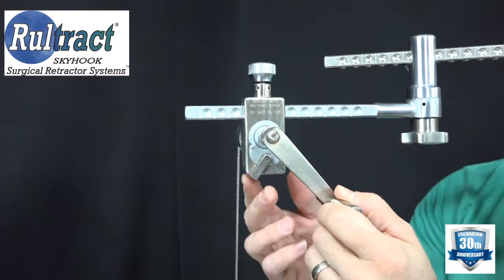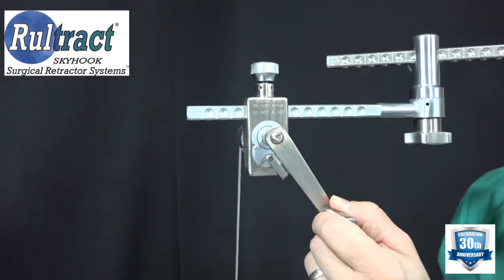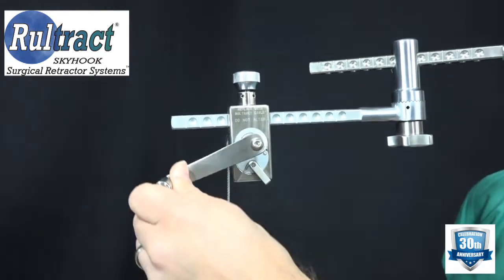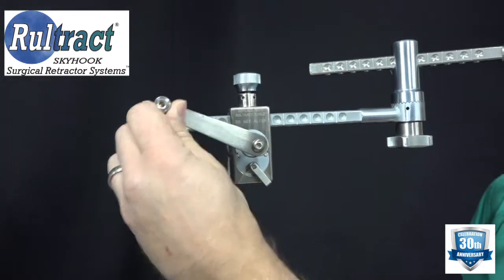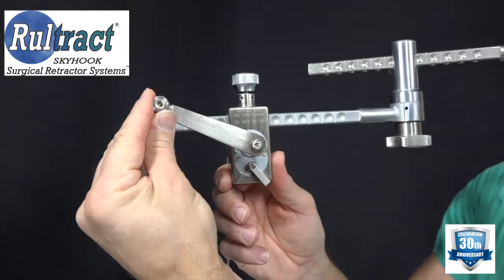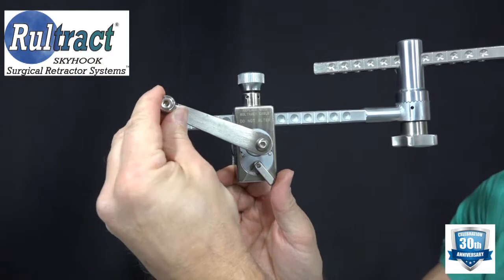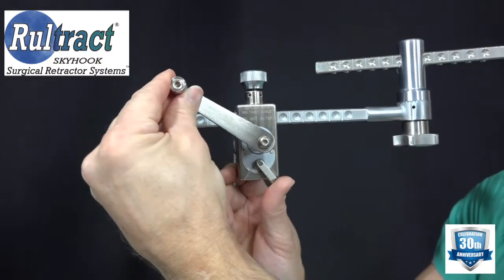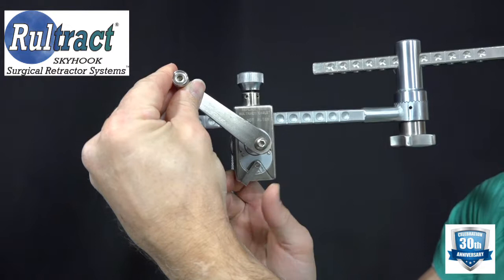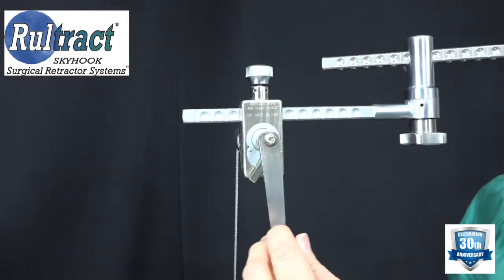If it needs to be elevated again, switch the lever to the opposite side and elevate. To lower again, since it won't move in one direction, move it in the direction it will move while holding it, then switch the lever and lower.